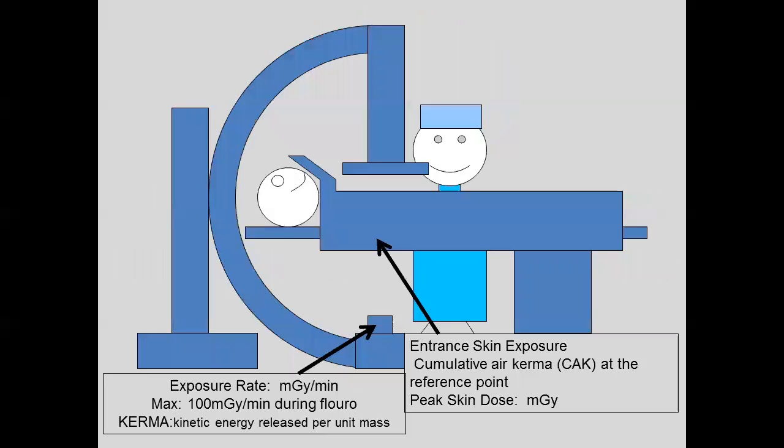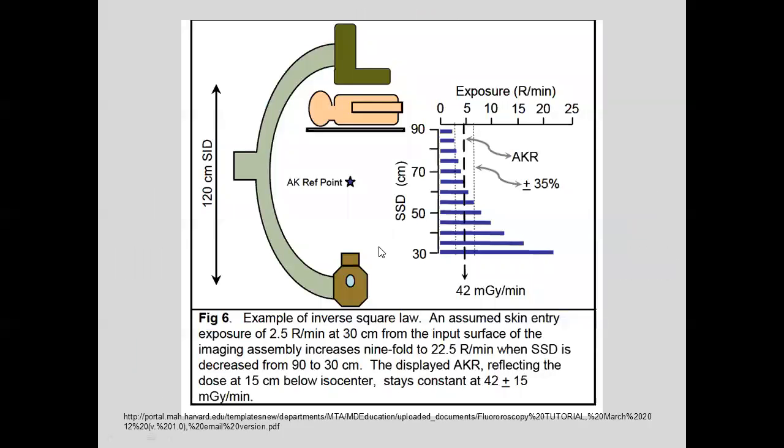Okay, all right. So once again, I like graphics. So exposure rates, entrance skin kerma is what's going to happen at entrance of the patient. Now the weakness of this whole measuring process is the radiation meter is calibrated, and each machine is calibrated a little different because they've changed the spots. When the dose rate meters first came out, they put it right here, right at the X-ray tube, because it was really easy. You put it there and you can measure how much radiation is there.